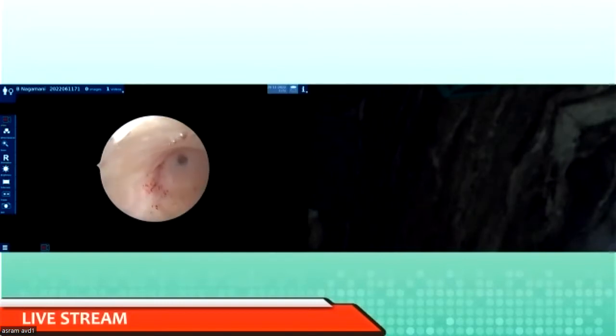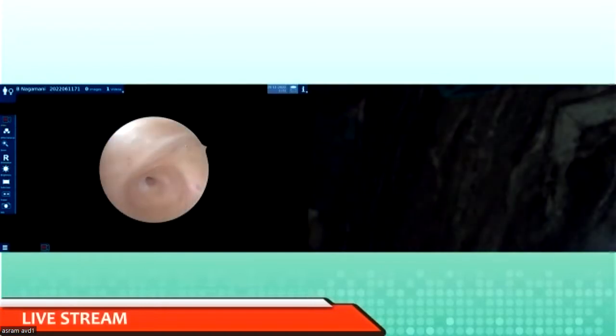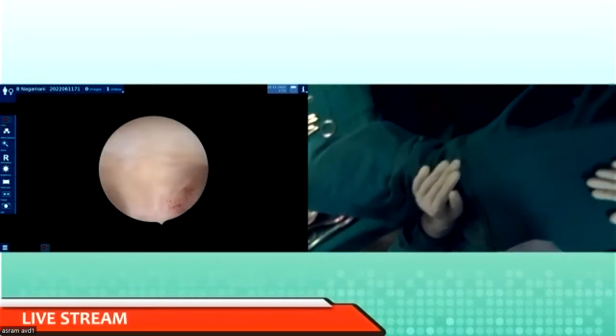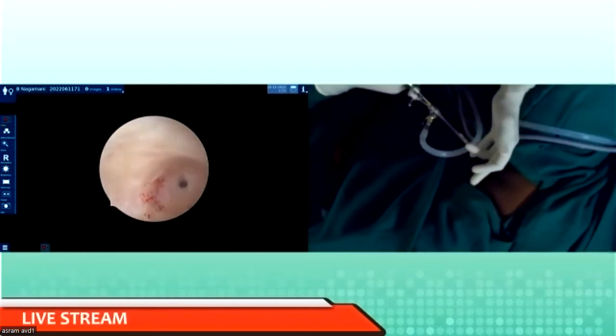So that is the left tubal ostium, and I am not going to repeat that. That is the right tubal ostium, central, sir. Keep your little finger so that you don't come in the way. Can you see that? Now there's a little bit of small septum, if you can see that.